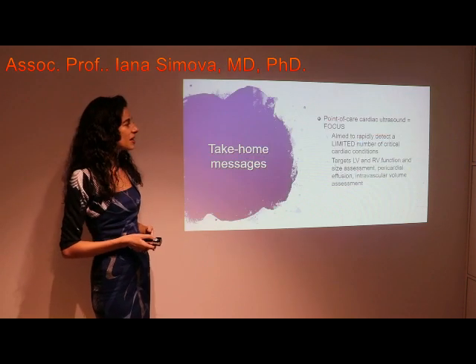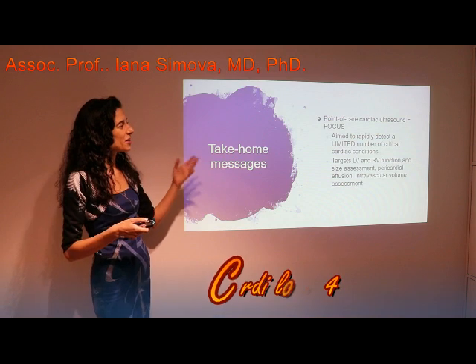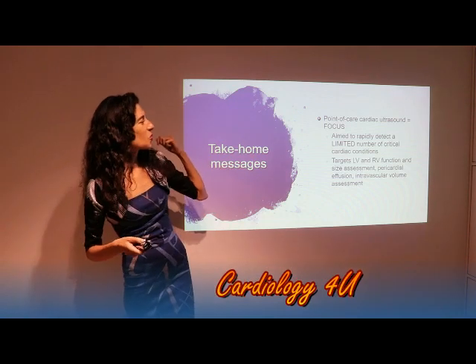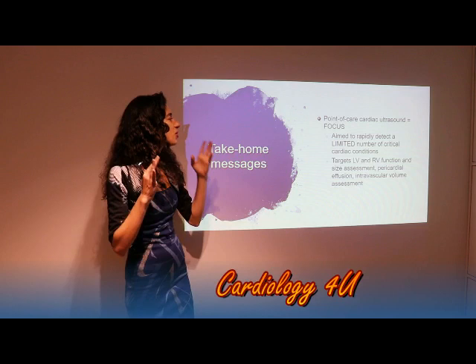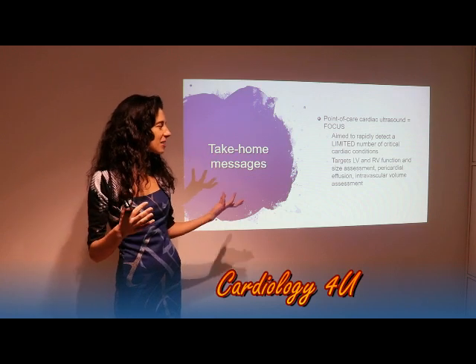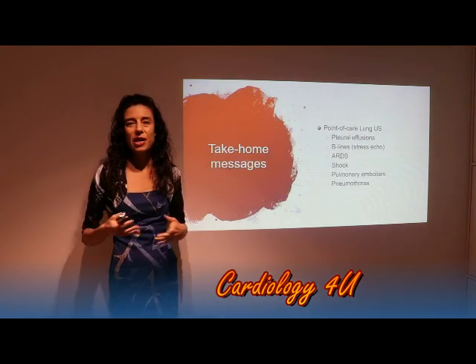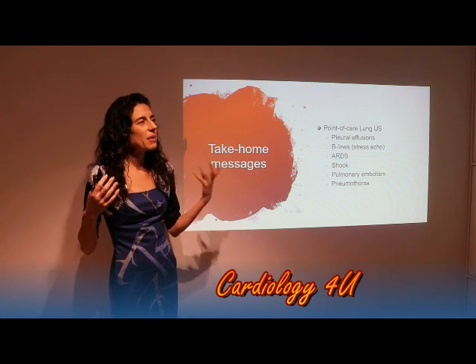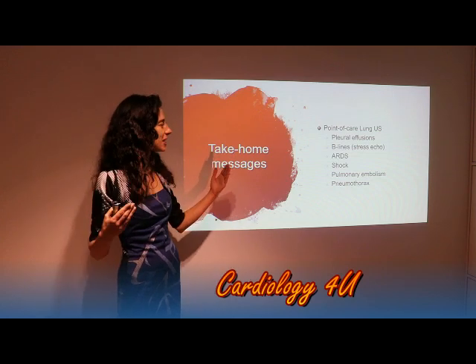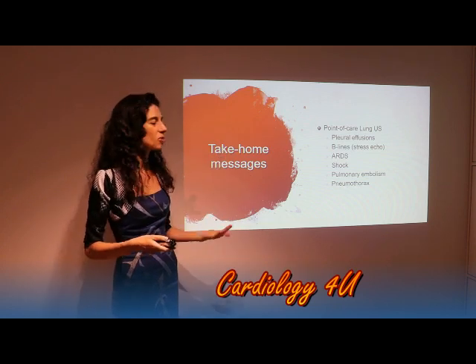So, my dear colleagues, the take-home messages of this presentation, I hope you enjoyed it, are first about the point of care cardiac ultrasound, which was the focus one, and to rapidly detect a limited number of critical cardiac condition targets: LV and RV function and size assessment, pericardial effusion, intravascular volume assessment. Then about the point of care lung ultrasound with its many, many applications, starting from the pleural effusions, B-lines, even during stress echo, acute respiratory distress syndrome, shock patients, pulmonary embolism, and pneumothorax.